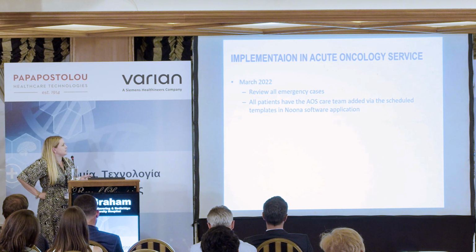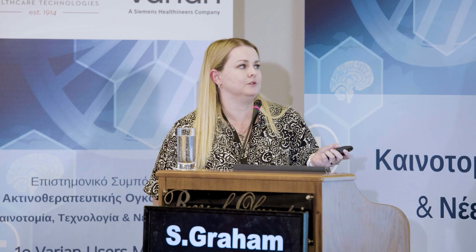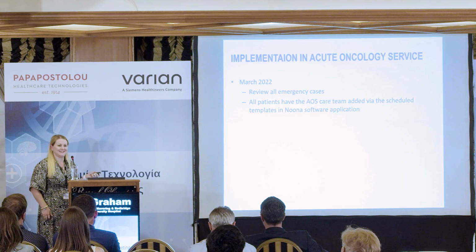In March 2022, so March of this year, we brought our acute oncology service on board. So they're our 24-hour emergency hotline, and so they're the ones that will review the emergency cases. So if a patient responds to a questionnaire or puts an ad hoc symptom report into the system, it automatically triages the cases as emergency, semi-emergency, urgent or non-urgent. And our acute oncology service have been looking at the emergency cases for us.